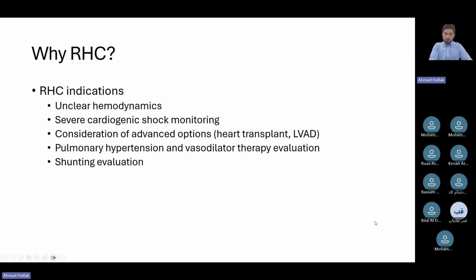And for those not familiar with the LVAD, it's just a left ventricular assist device. There's the temporary, and then there's the permanent. Temporary left ventricular assist devices, like the Impella device, or even, I guess you could consider a balloon pump, are temporary mechanical circulatory support. The permanent ones, the LVAD, like the HeartMate 3, is pretty much the only one currently being used. It's surgically implanted in the apex, where the inflow is, and the outflow is in the aorta.